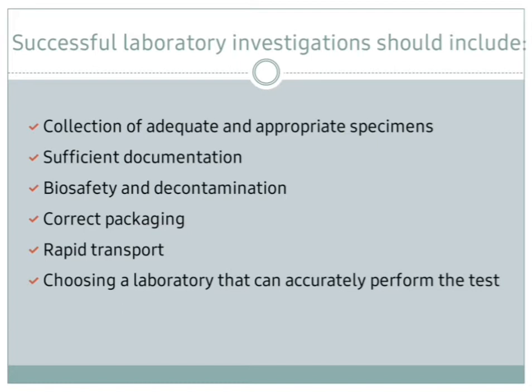Rapid transport لأنه كلما تأخر الترانسبورت قد تموت البكتيريا أو يموت الانفكشن اللي المايكرو أورجانيزمز أو يصير به proliferation أو أي عوامل أخرى راح تنطينا أخطاء بنتيجة الفحص. لذلك الترانسبورت يجب أن يكون rapid. And choosing a laboratory that can accurately perform the test that we need.